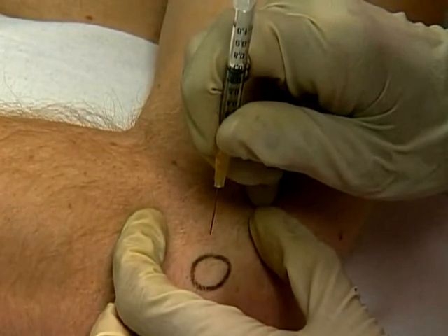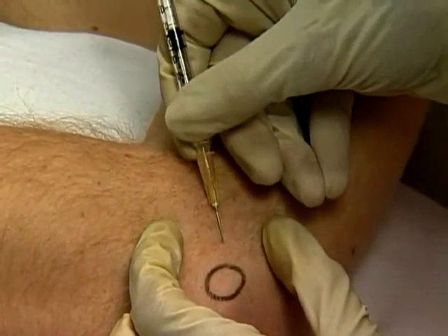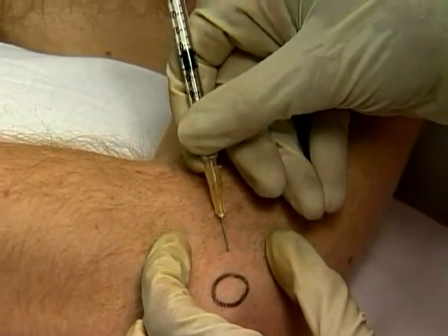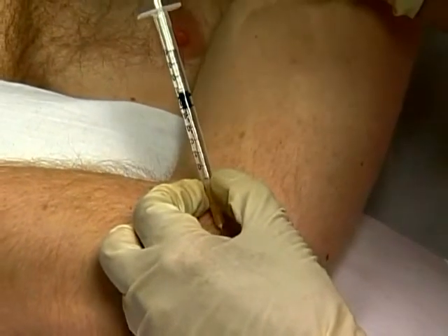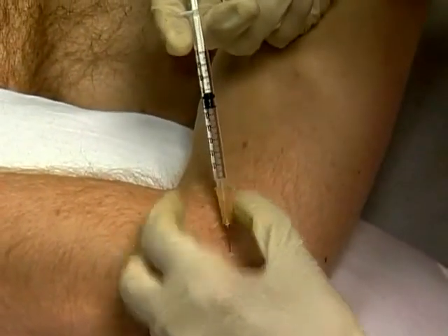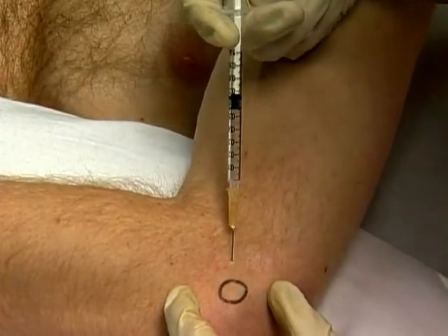Fix the injecting hand, firmly stretch skin, and rapidly insert needle perpendicularly. Subcutaneously angle down to gently touch the facet, aspirate, and then pepper the solution by depositing 8 to 10 droplets within the tendon at the enthesis.